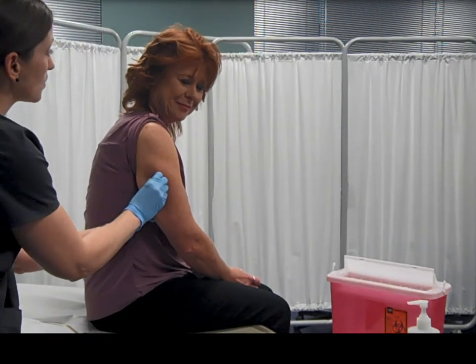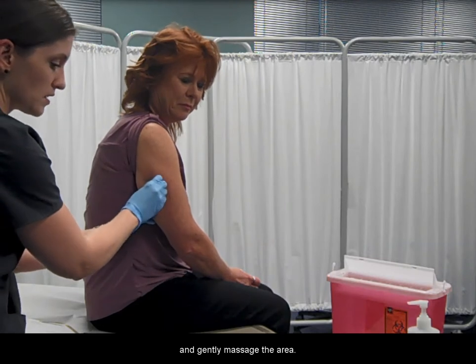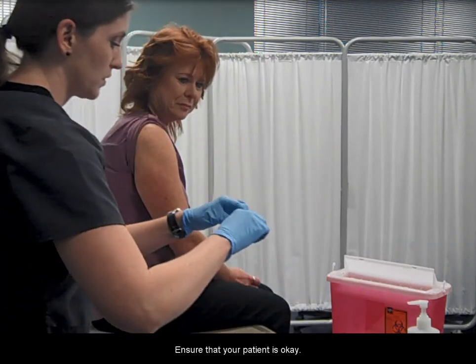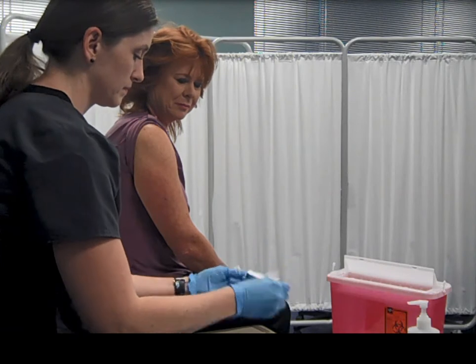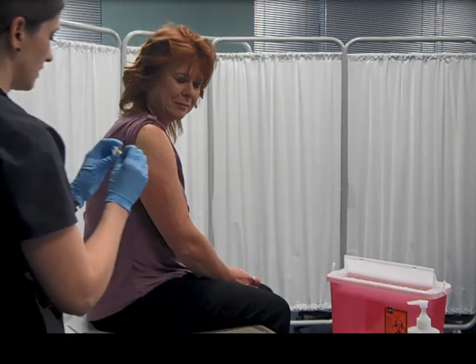Wipe the site and gently massage the area. Ensure that your patient is okay. Apply a bandage as needed.